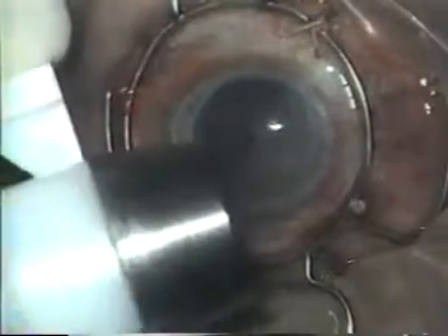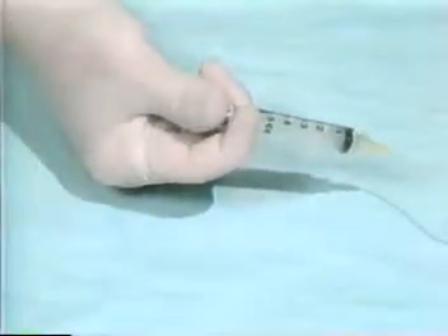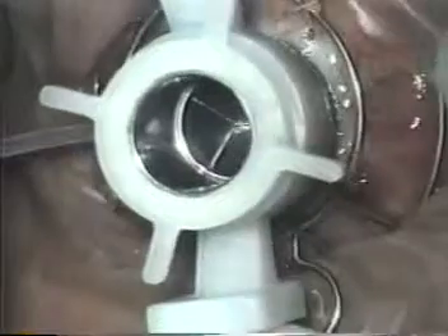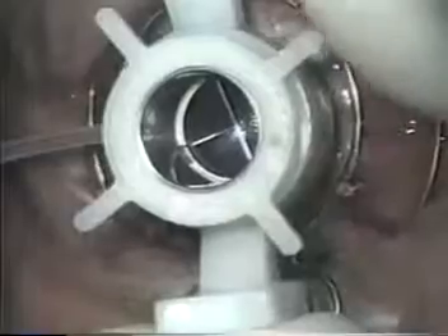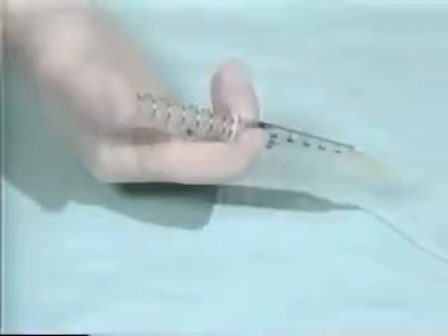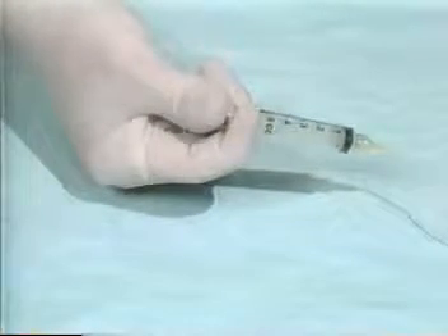The blade is then retracted three spokes and the plunger of the syringe is pushed in all the way. The crosshairs of the trephine are then aligned with a centration mark that has been made on the cornea. The trephine is pressed evenly on the corneal surface and the plunger is released abruptly to create a vacuum. The trephine is stabilized by gently holding the struts and the cornea is cut by turning the spokes clockwise. The initial three spokes turned lower the blade to the zero position. The number of spokes to turn further depends on the desired depth of cut and the corneal thickness. It is recommended that the cornea be cut as close to Descemet's membrane as possible. After the cut has been made, the trephine is removed from the cornea by pushing the plunger of the syringe in all the way, which releases the vacuum.